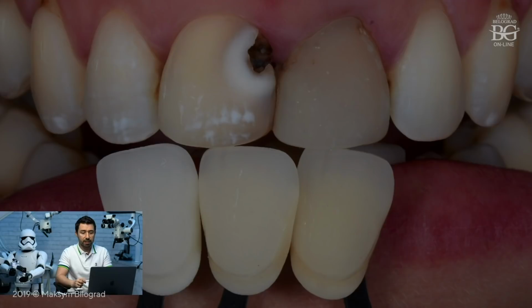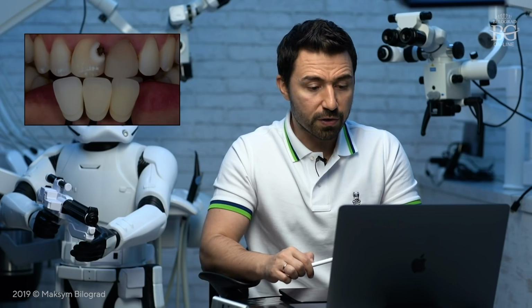In this case we are not changing the color of teeth. We need to integrate two ceramic crowns into the biological or aesthetic envelope of our patient. So basically we need to fit our metal-free crowns with adjacent teeth. In that case, it is really important to share with your dental technician enough information about the color. And one of the best options to share color information with your dental technician is to utilize a polarized filter.